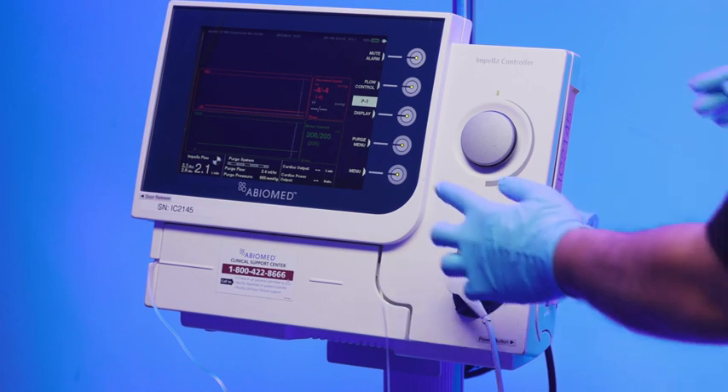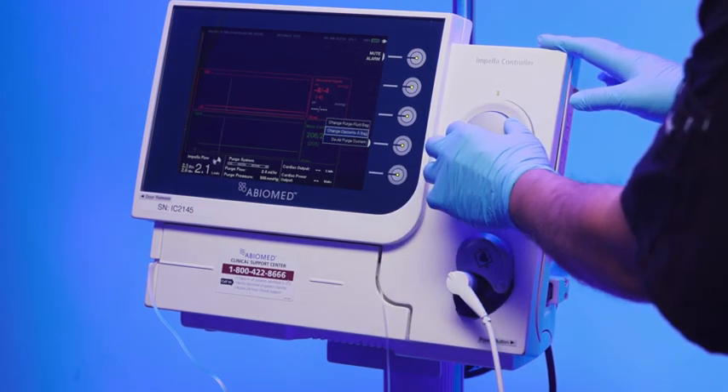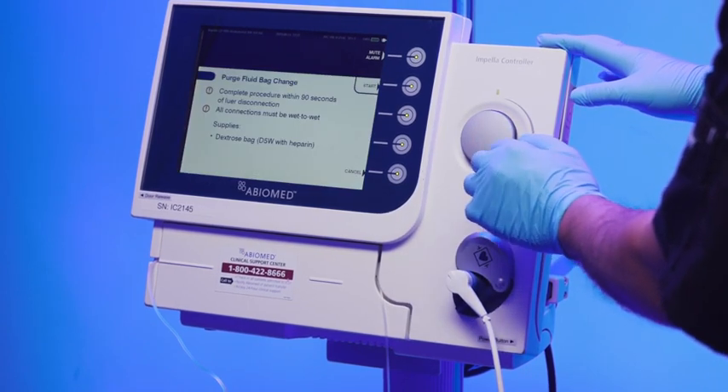To begin the change purge fluid bag procedure, select the purge menu soft button. Use the selector knob to scroll to change fluid bag and press in on the selector knob.